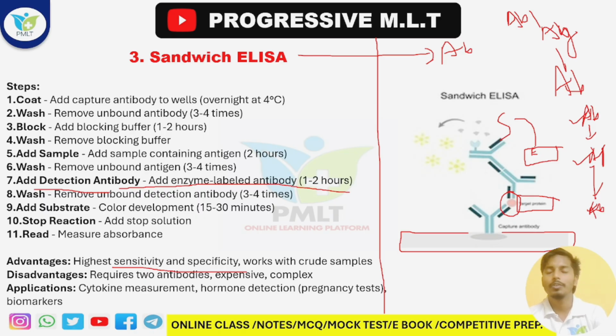Okay, most of the ELISA steps depend upon the company, and how much time you have to give for every particular step, you will find in the manual of the company you are using, as well as the kind of ELISA you are using. So I am not covering the particular details. You have to read the manual before doing the test. Okay, here the same things are also mentioned. Just look at the particular things.